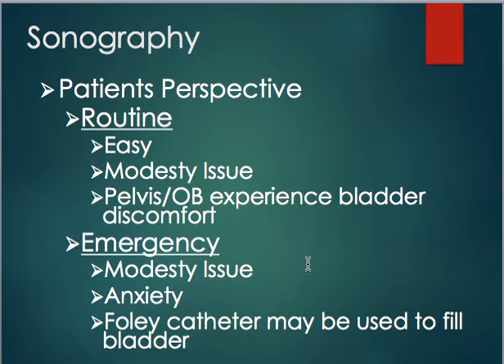Filling that bladder takes a little bit of time. Remember, for the prep, they have to drink 32 ounces of water 1 hour prior to the scan time. Well, we don't have time to wait an hour for that bladder to fill in emergency situations. So a lot of times what they do is they have a Foley catheter put in place, and they manually fill the bladder up to eliminate that wait time so that we can scan the patient quicker.